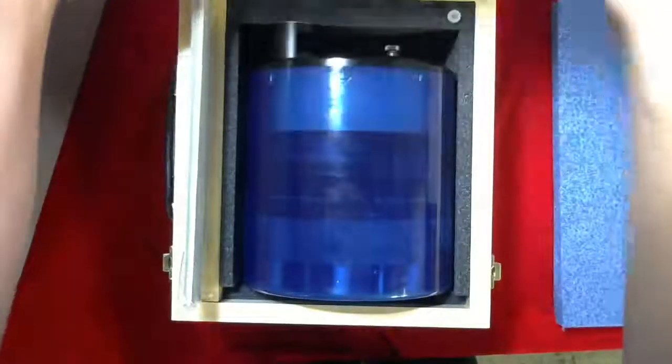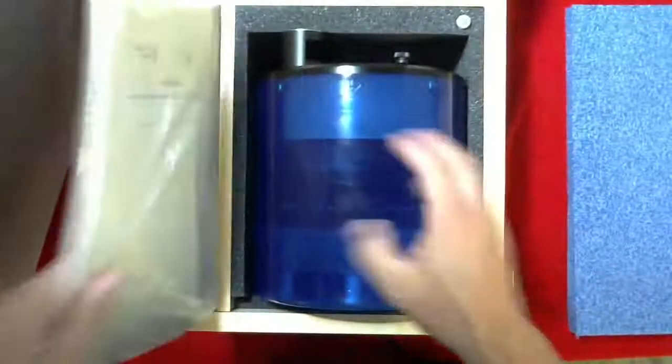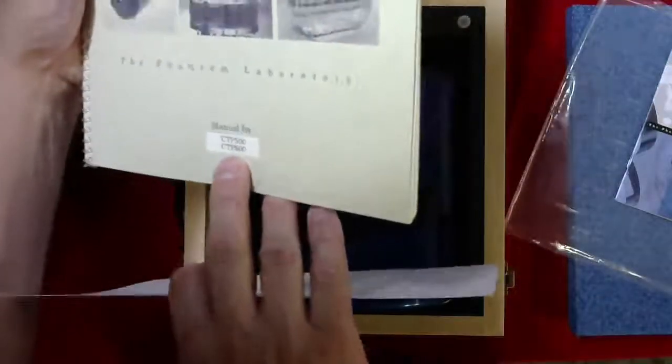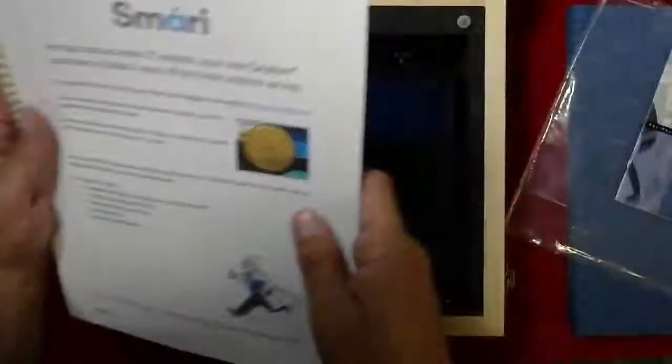As you can see inside here, we'll start with the manual. This is the manual for the CAT Phantom. This is a CAT Phantom 600, this particular model, and you can see it.